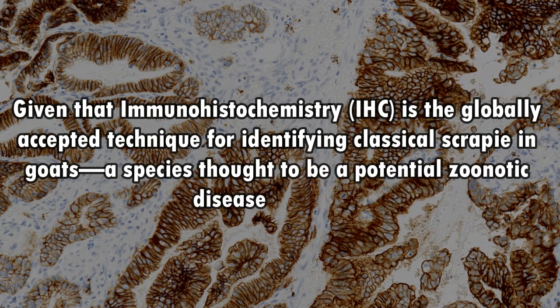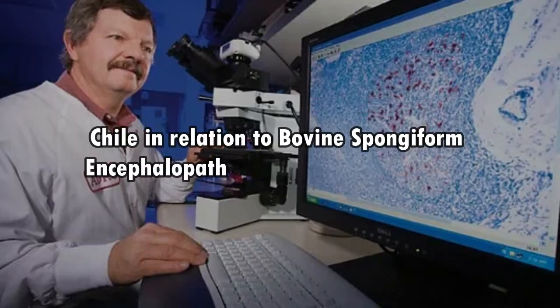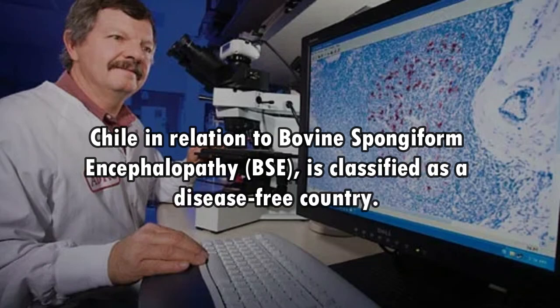Immunohistochemistry, IHC, is the globally accepted technique for identifying classical Scrapie in goats, a species thought to be a potential zoonotic disease reservoir. Chile, in relation to bovine spongiform encephalopathy, BSE, is classified as a disease-free country.